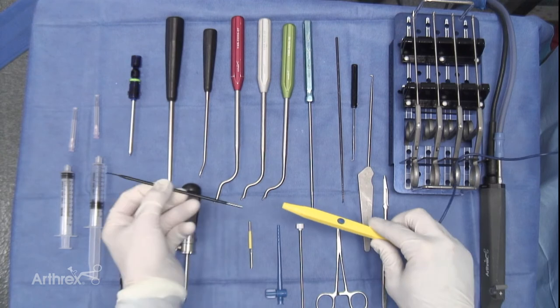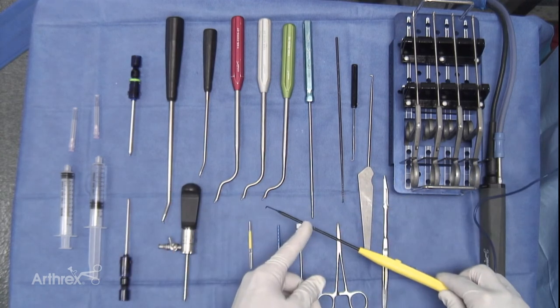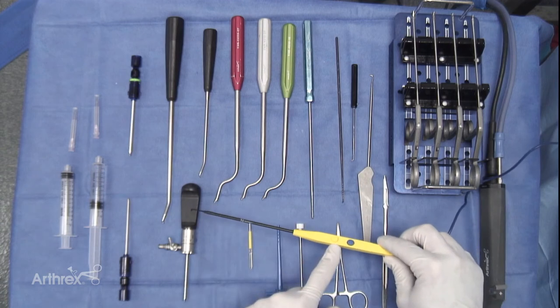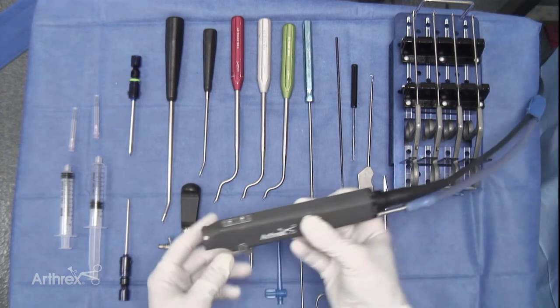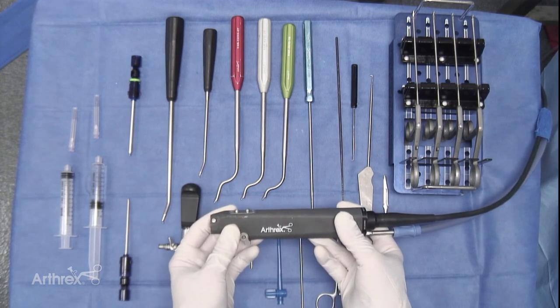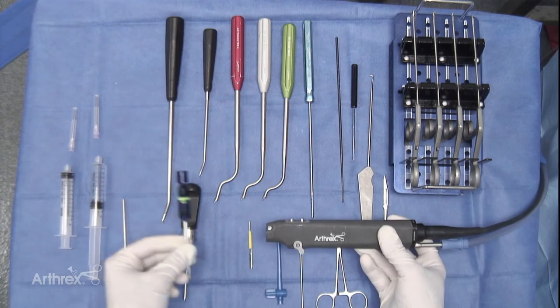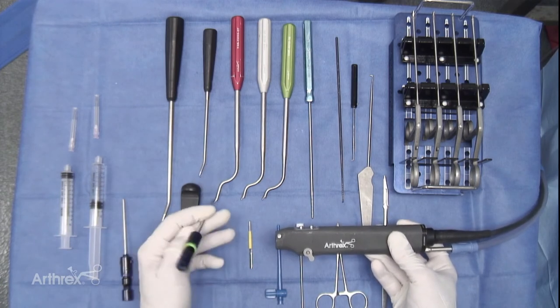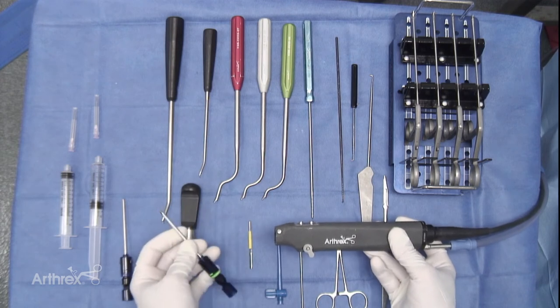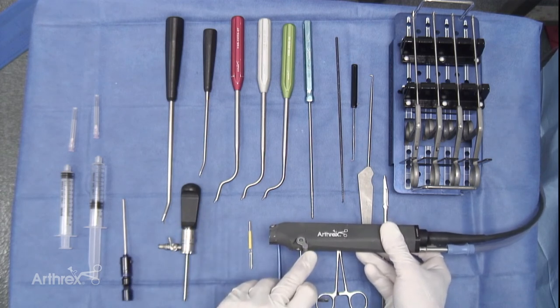The spatula tip can be removed and the specialized tip inserted. Placing the right angle of the tip opposite to the activation buttons makes this process smoother. The shaver is also present — it is important with a small joint shaver that one has several different shaver options. The most common option we use is the four millimeter torpedo, and the opening of the torpedo should be placed in the opposite direction to the suction control lever.